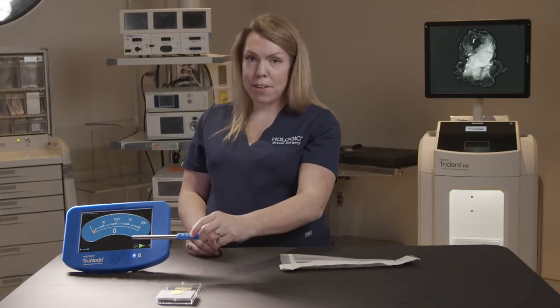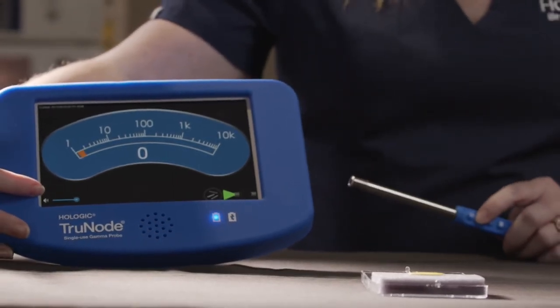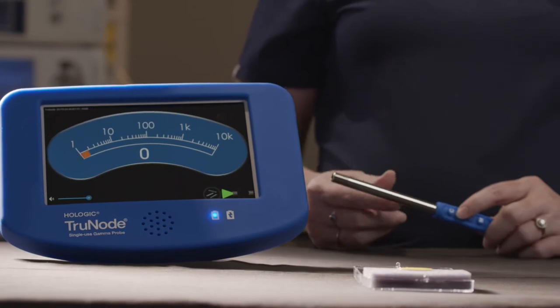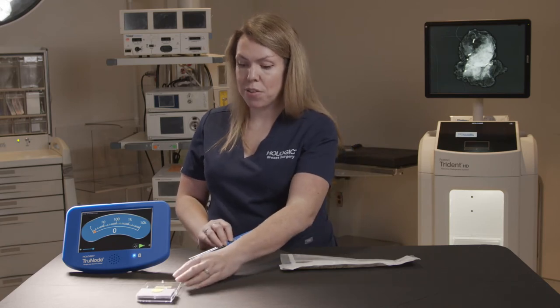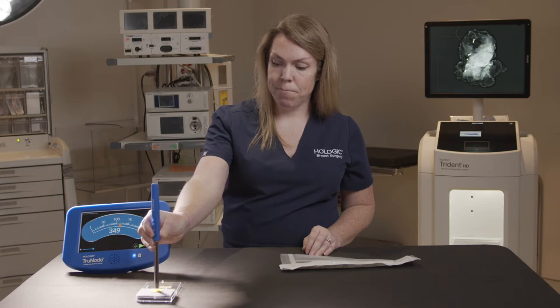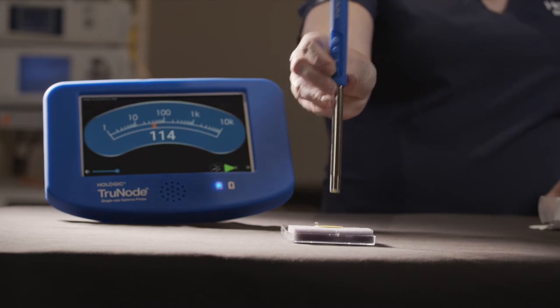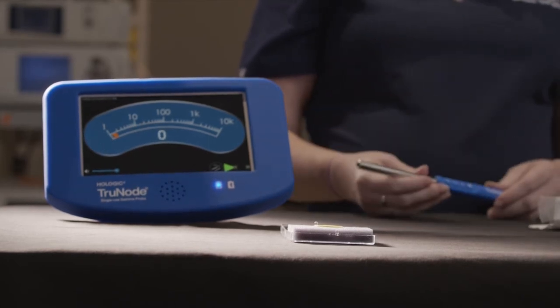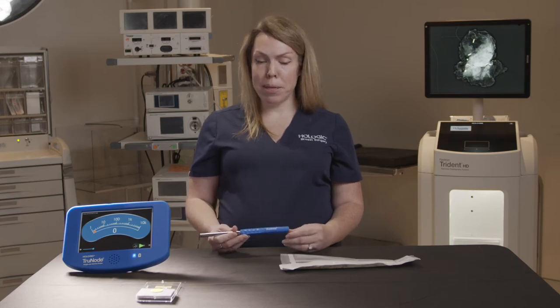The plus and minus buttons allow us to change the volume — you can see where the volume control is being changed down here — and then the C button provides us with a count. I actually have a radioactive source right here in front of me. You can see by hitting that C button whenever it's over the radioactive source that we can get a count of whatever area of tissue we're in front of at that moment. Those were all the short presses on the probe.